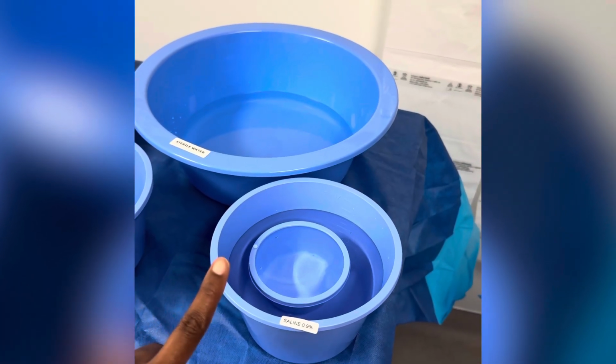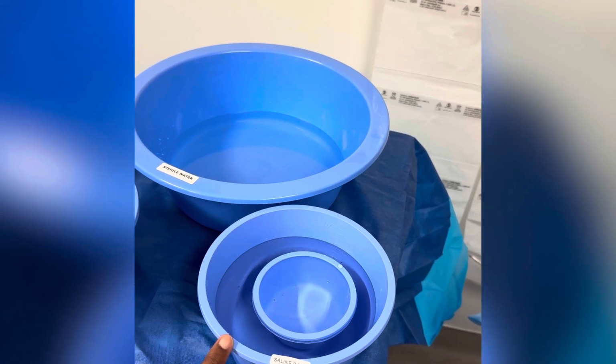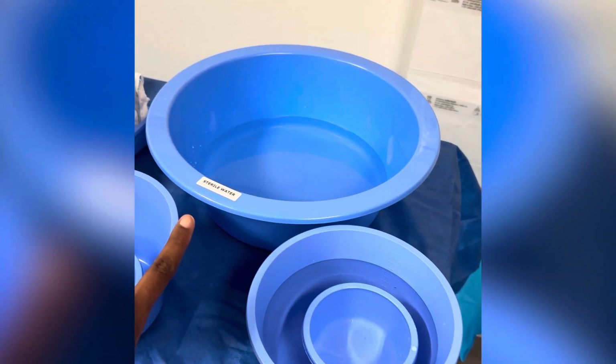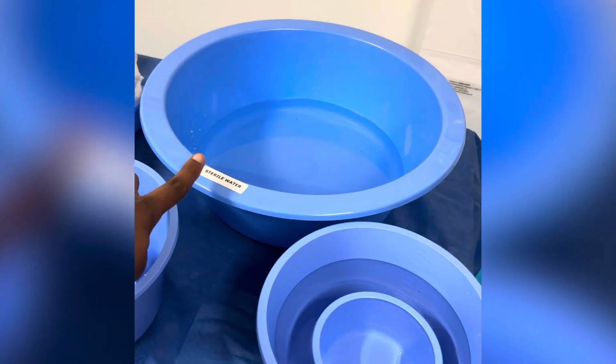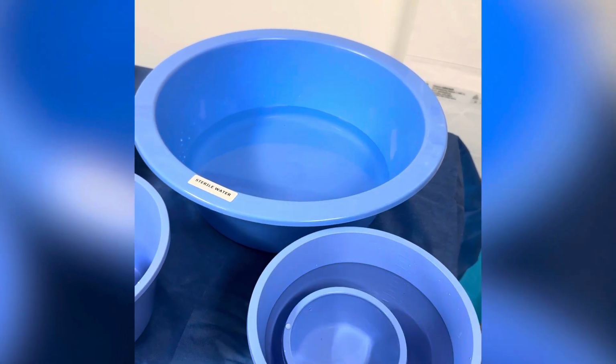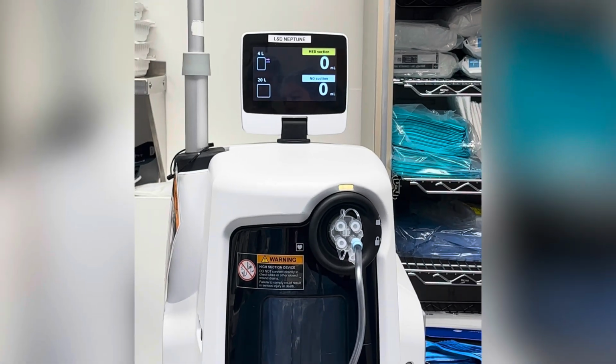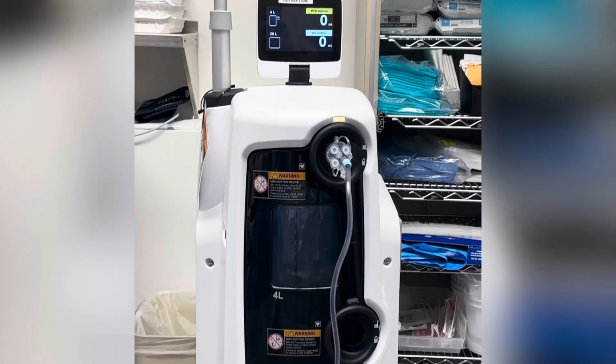To quickly recap, we have 1,000 mLs of normal saline used for irrigation and will count toward our subtracted fluid amount. We also have our sterile water used only to clean instruments and will not count toward our subtracted total fluid amount. At the beginning of the case, verify the Neptune is reading 0 mLs.